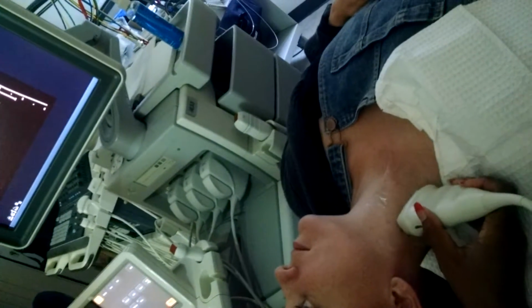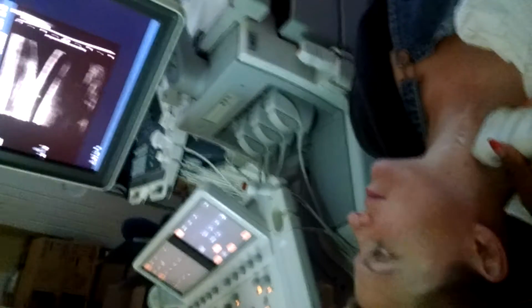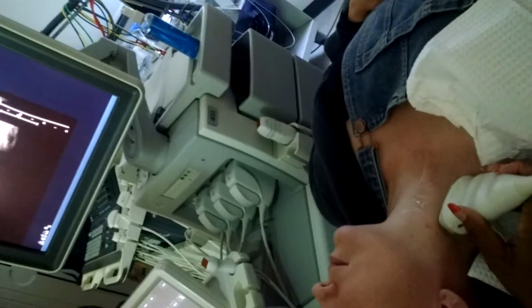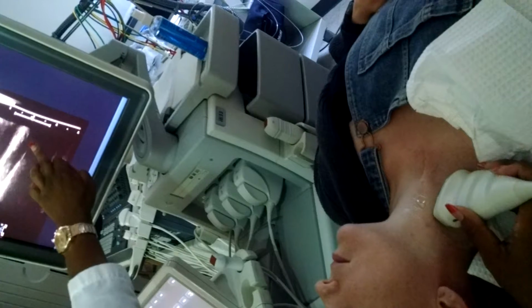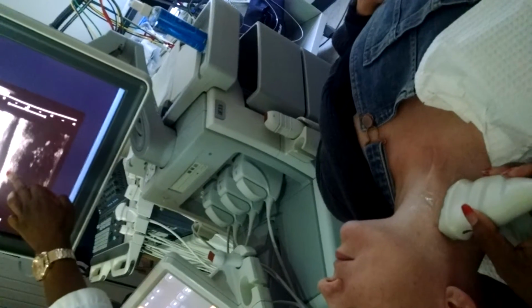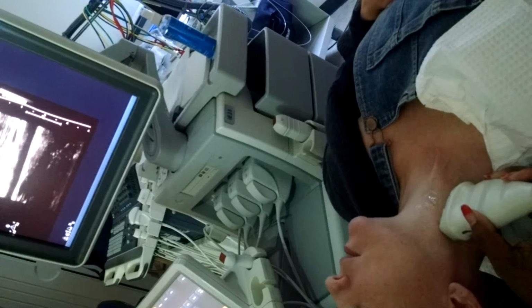All right. So you want to take your pictures and the approach that's best for that vessel. I want to see all the way down towards the clavicle if possible. And I can tell if you're proximal by the way the vessel shape's coming off the arch. And then as you move up, it becomes more parallel to the screen. So the fact that it was tapering there, you know that you're in the right position.